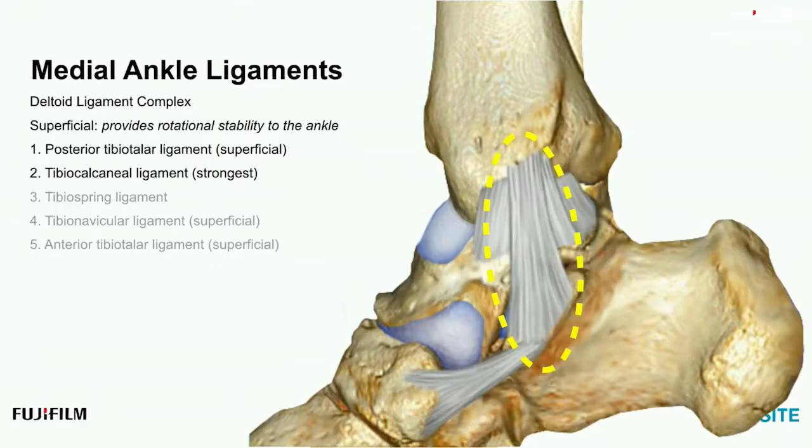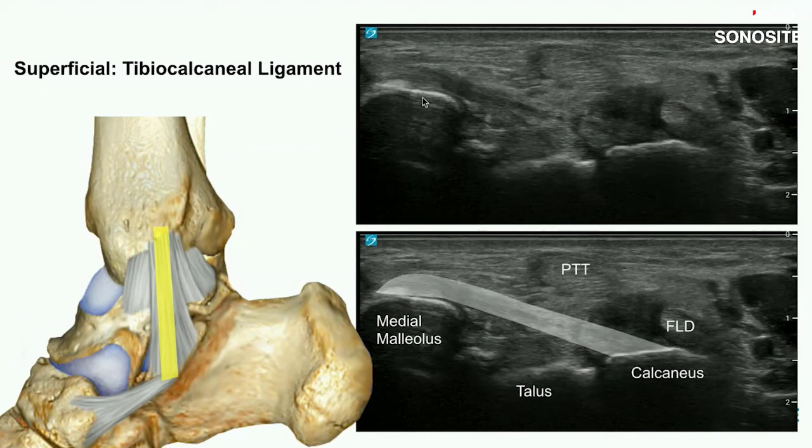The neighbor that steals the show is the tibial calcaneal ligament — it's the strongest. It is larger, broader, thick, and dense. It shows up nicely with anisotropic artifact, but it's still part of this complex. Here's the tibia, calcaneus, and talus. It bridges that gap. We're running the transducer slightly more anterior, more mid-coronal. Plant the proximal aspect of the transducer and swing the distal aspect until you see the calcaneus, specifically around the sustentaculum tali.